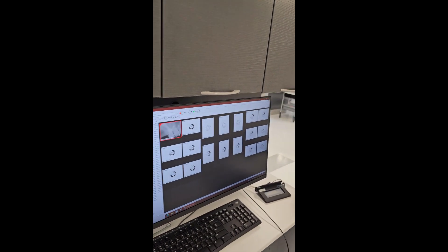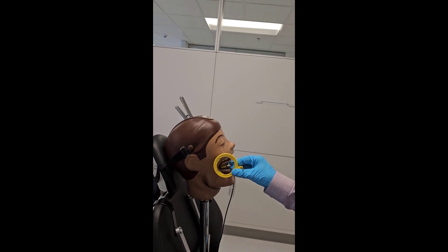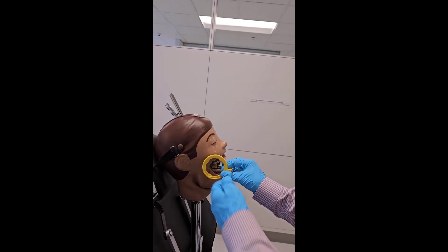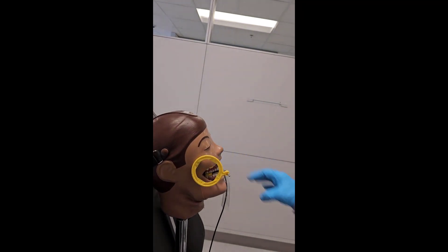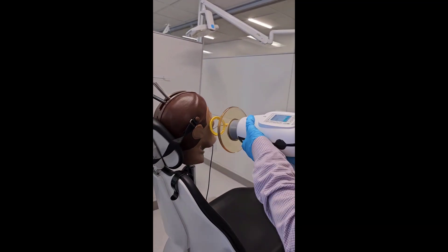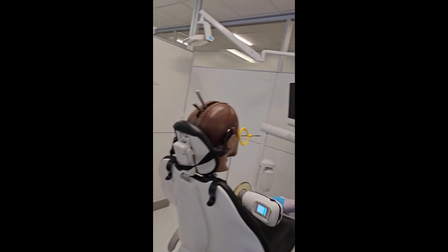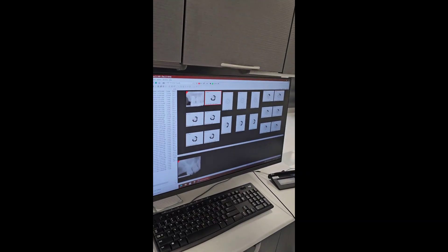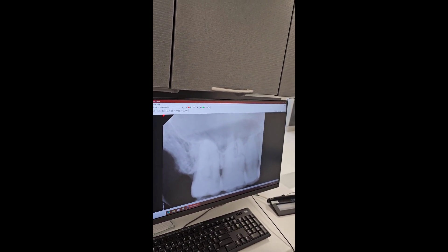So let's see how we correct that with more proper angulation. Basically, I'm going to just flatten this out a bit. Make sure the patient's biting on the bite tab — to do that sometimes you have to push it further into the patient's mouth, find that deepest part of the palate where it can really go up there. There's going to be maybe a little bit of vertical angulation, but not nearly as much. When he bites down, he's bitten down almost to the second molar. Now if I do parallel, just a little bit of positive vertical angulation coming down — see how that affects our diagnoses of the apices. Now we don't even see the zygomatic process of the maxilla, and I see plenty of the roots, so I didn't need that steep angulation to capture it.